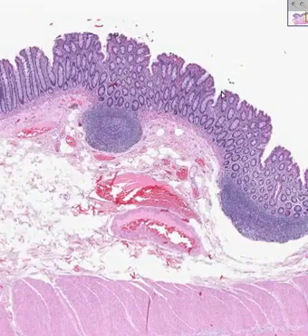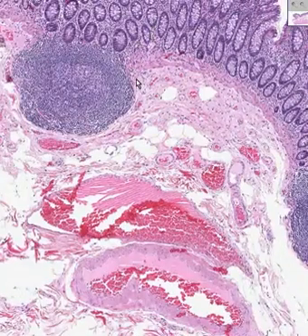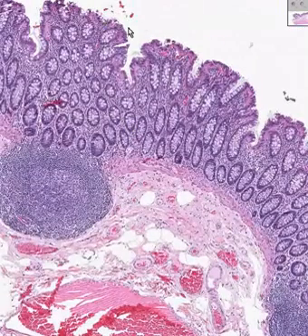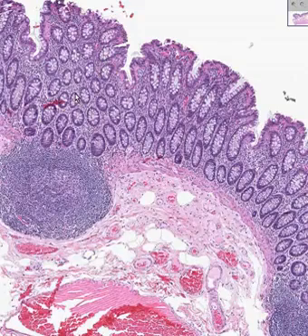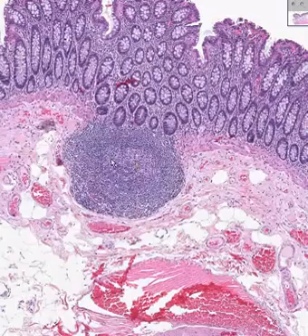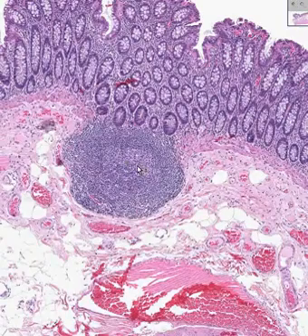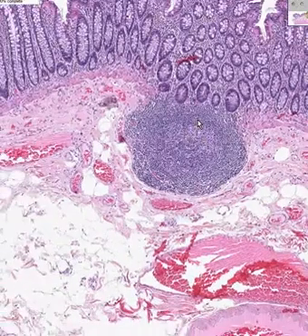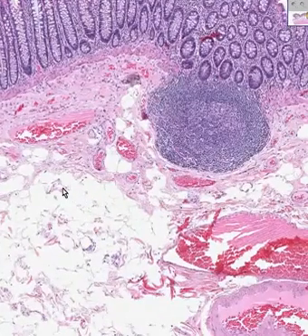Here is the mucosa. Notice the mucosa does not form really papillary structures where you have finger-like projections on the outside. Rather than that, the glands go inward to form these pits. Notice that in the lamina propria and submucosa, it is quite common to find lymphoid follicles. This is a secondary lymphoid follicle because it has an inner germinal center. Notice then you have quite an abundant amount of loose connective tissue, fat.